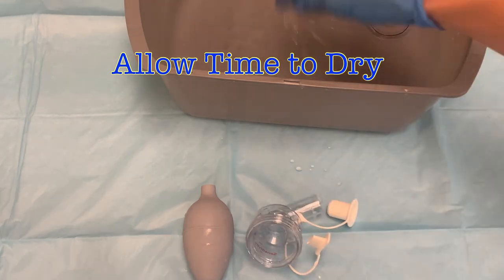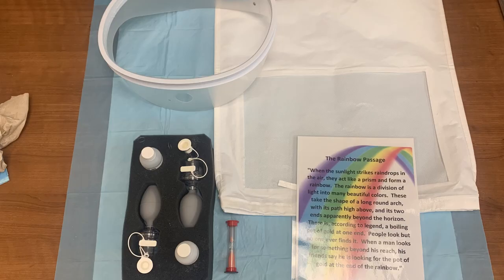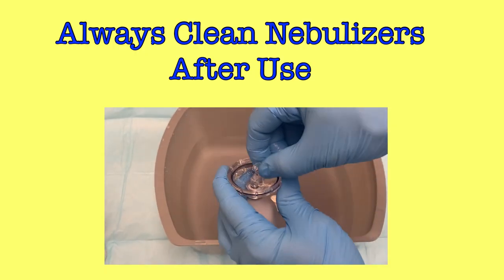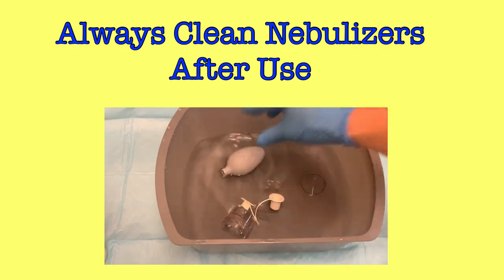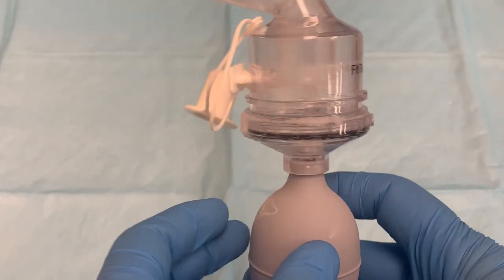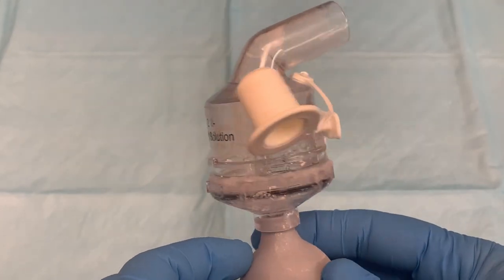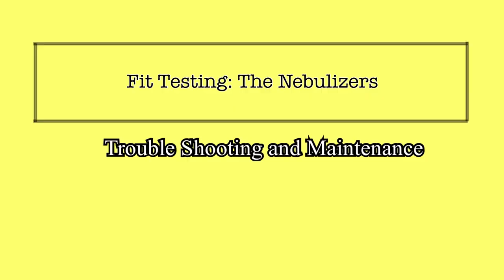After allowing the nebulizers to soak and clean, allow them to dry before reassembling. Then store them with your fit testing supplies until they are needed again. Always clean your nebulizers after use. Even if they are still working well when you finish, there is likely some sugar still present in the device, and it will crystallize over time and clog the nebulizer. You don't want to assemble your supplies for your first test of the day only to find the nebulizers are already clogged.